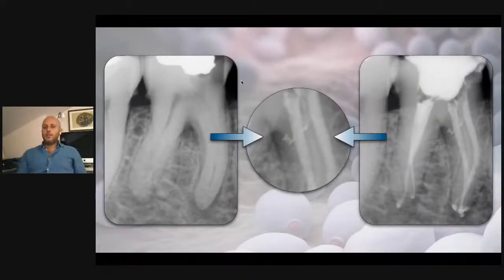We can find endodontic lesions at different levels of the root. In this case, this lower molar had an interradicular radiolucency lesion without any kind of periodontal probing. That means that we can have a lateral canal at that level. In fact, I did the treatment, I did my best to clean and to disinfect the root canal, and when I obturated, I sealed the root canal space, I found that lateral canal at the level of the bifurcation of the roots. And that's not the only case.